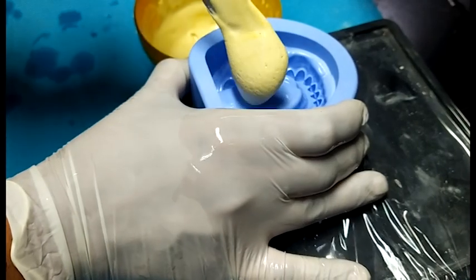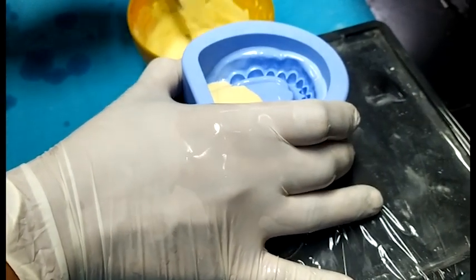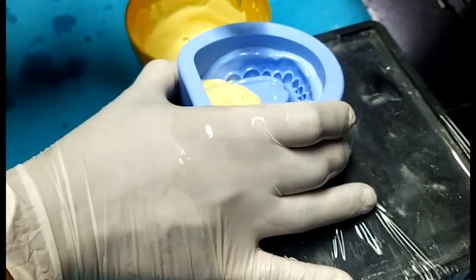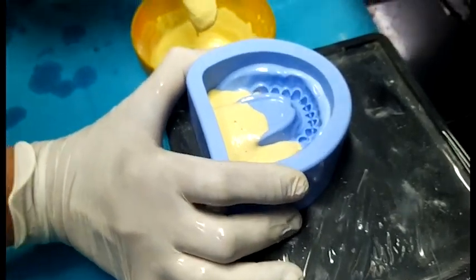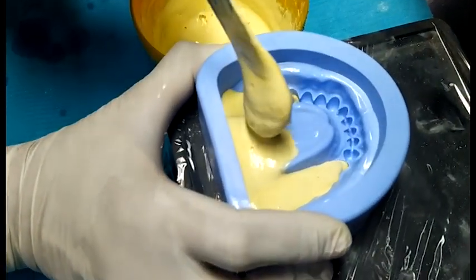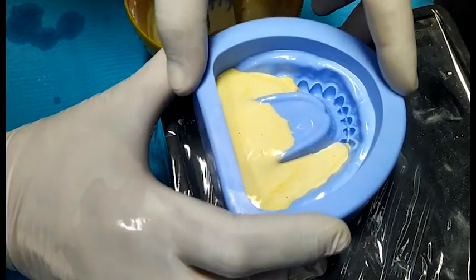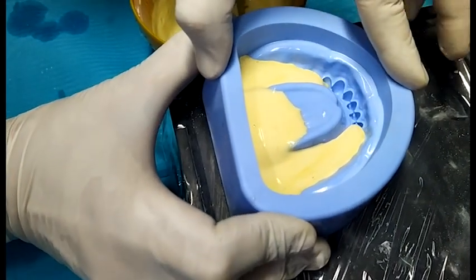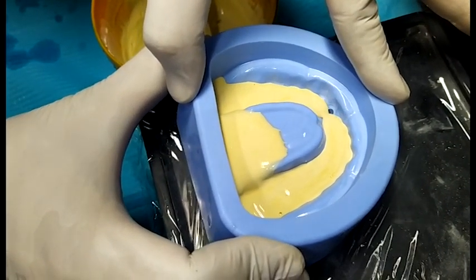It is a general rule to always fill the teeth first, because the teeth area is more prone to undercuts and porosity — especially in the anterior mandibular teeth, which are very small. So there are more chances of porosity. Always fill the teeth first and then fill the remaining dental mold.